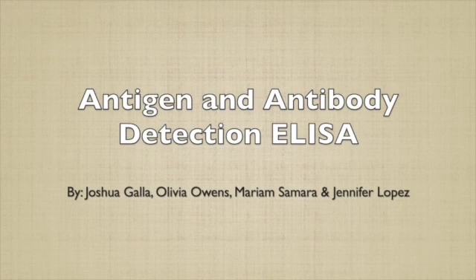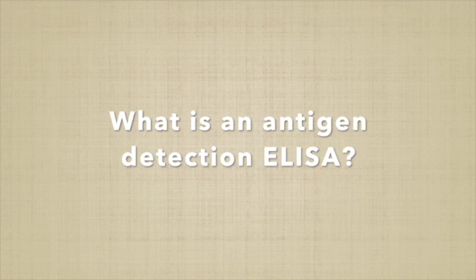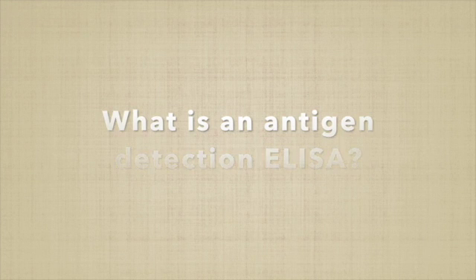Welcome. Today we will be conducting a discussion on the ELISA disease detection model by modeling the general questions and components associated with antigen and antibody detection of the SARS-CoV-2 virus. The antigen detection ELISA model measures the antigen-antibody interaction of an unknown virus and known antibody. Its main goal is to test for the presence of antigen in a patient's sample.